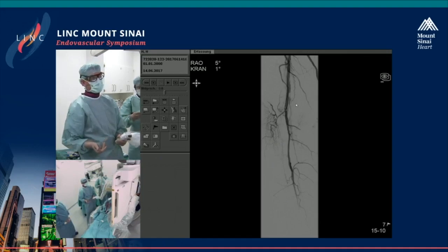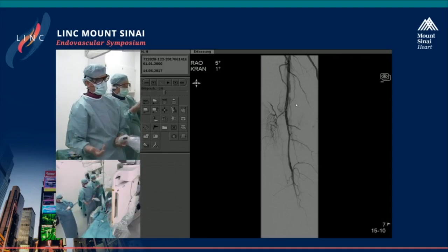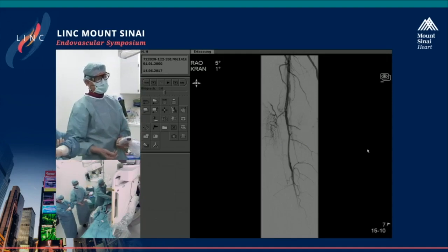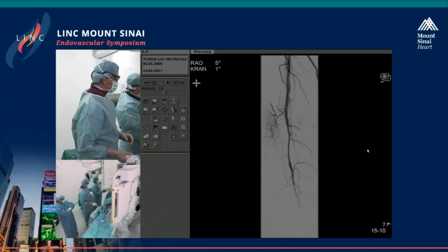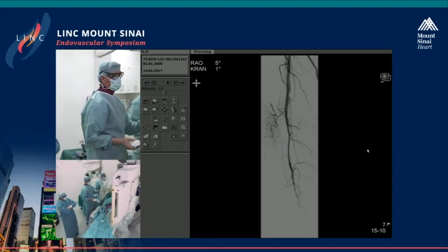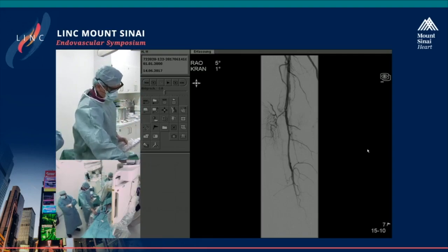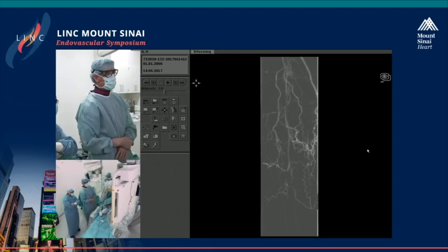And nevertheless, we thought to now first start with the bullfrog device to get the dexamethasone into the arterial wall. Later on, we have to decide once again whether we have to stabilize with a stent. But I think this sequence is better. First, take the drug into the arterial wall and then think of maybe stenting that area. So therefore, you can see here, we want to start here.